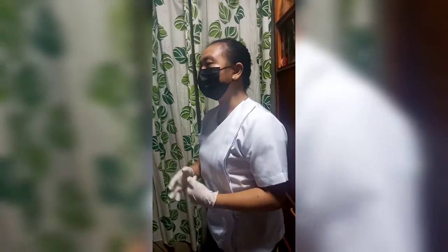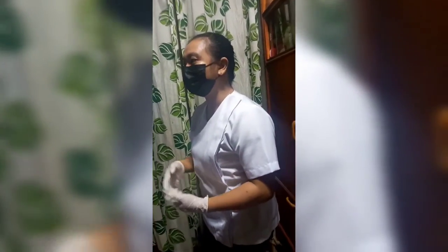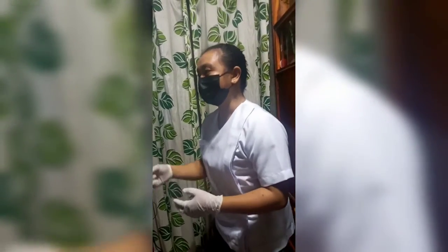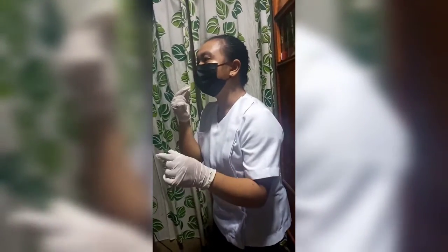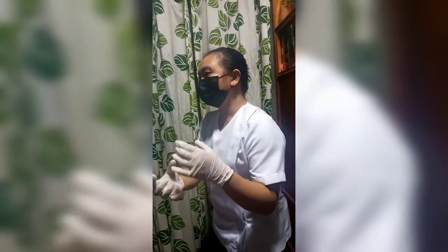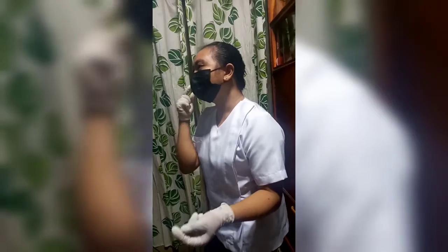Ma'am, ang gagawin po natin ngayon ay ang tinatawag na administering oxygen via nasal cannula. Gagamit tayo ng nasal cannula. May tube po siya na clear na ilalagay natin sa ilong natin. Konektado po siya sa oxygen tank. Yung oxygen tank po natin ay meron siyang regulator kung saan meron pong cup na lalagyan natin ng tubig para hindi mag-dry yung ilong nyo.